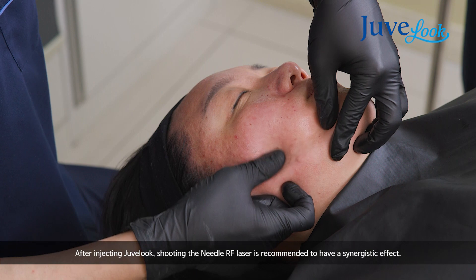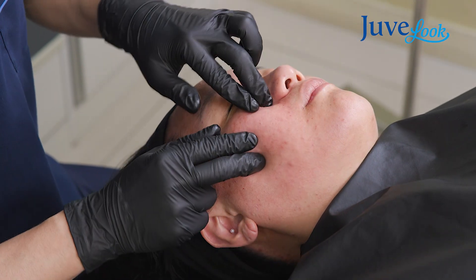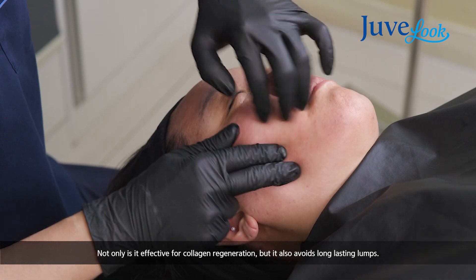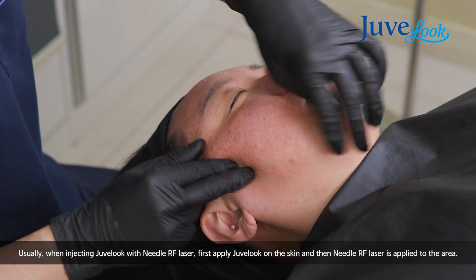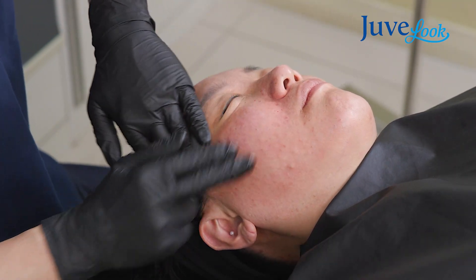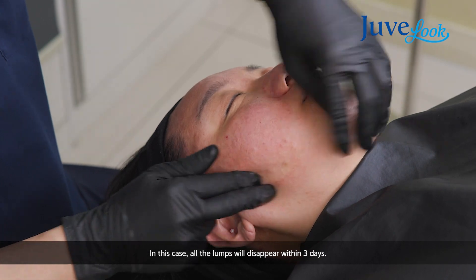Also after injection, needle RF is a quite good combination device — you can not only increase the effect but also avoid long-lasting lumps. Usually combine needle RF with injection first and RF later. These lumps usually disappear in one or two days, sometimes three days, but not more than one week.